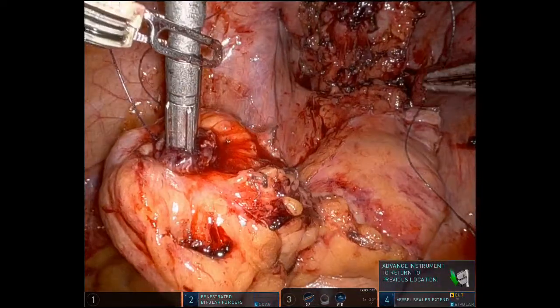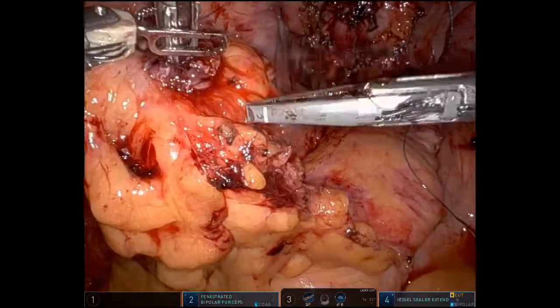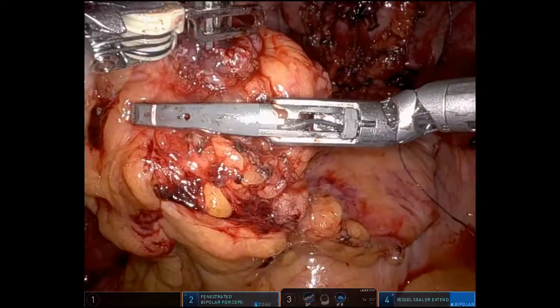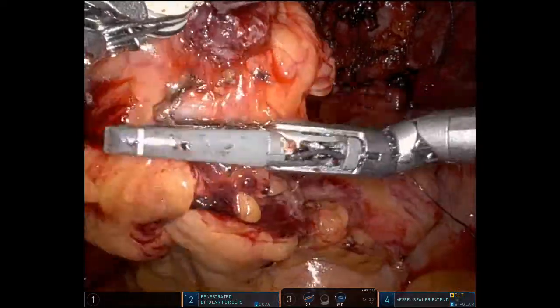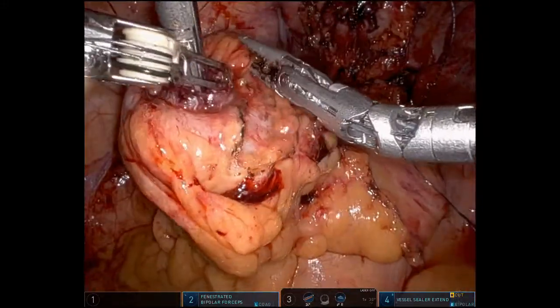we go back to the left colon, and this is really the part I wanted to highlight. I just don't like the way that looks — I think we've all been there before. There's diverticular disease, and even once we resect the acute diverticulitis portion, we have to make sure we have a smooth edge on the anvil. And you just can't trust it.